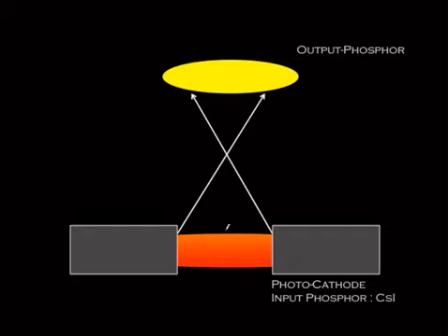So you do have to pay a penalty for that. Your choices are to either have an image that's not diagnostic, or you end up increasing the juice. I'll talk about this a little bit more as the talk goes on, but there's this entity called an automatic exposure control, which is like a monkey that sits back here and looks to see if it's bright enough. And if it's not bright enough, it automatically increases the juice.